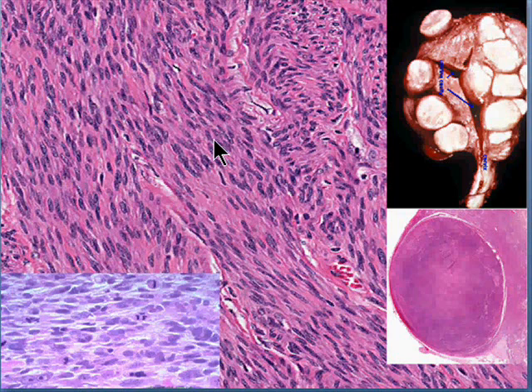And generally, benign tumors are extremely well differentiated. That's why they're benign. On the other hand, if you look in the southwest here, you can see 1, 2, 3, 4, 5, 6 mitoses, big cells, dark cells, things we're going to define later, and you're going to say, you know what, this doesn't look too good. I suspect this might not behave too good. Well, the fact is, these are smooth muscle tumors arising in the smooth muscle area.